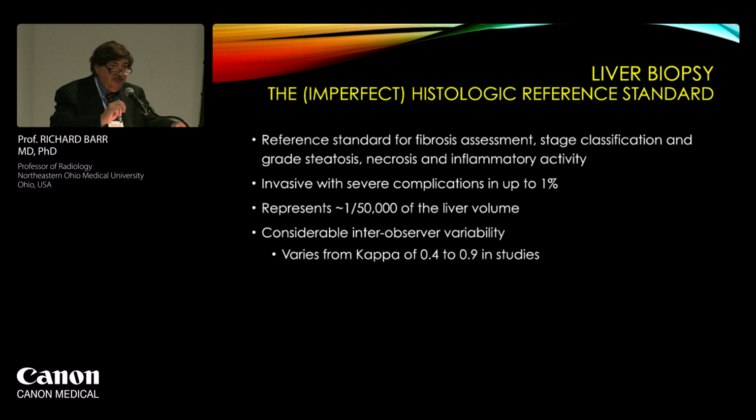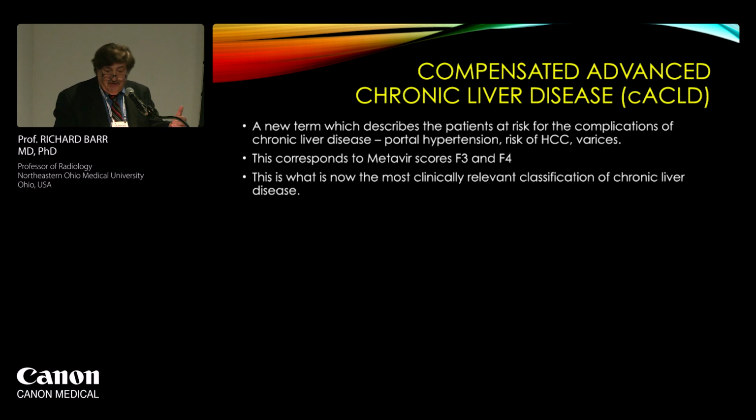One thing I think is really important to realize is that liver biopsy is not a very good reference standard. When we look at studies of pathologists reviewing the same slide, they don't do a great job. There are papers that show that one pathologist may call something metavir 1, and a different pathologist may call the same slide metavir 3. So they sometimes are off by 2 metavir scores. So if we try to analyze our results compared to liver biopsy, it's not a really good reference standard, and we'll talk about how we overcome that.